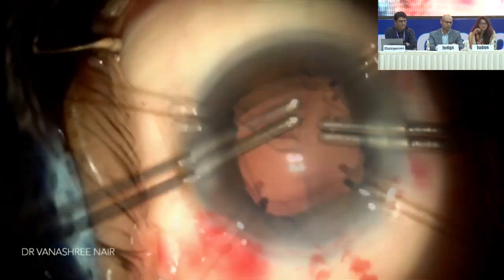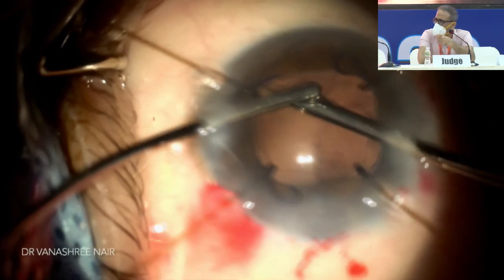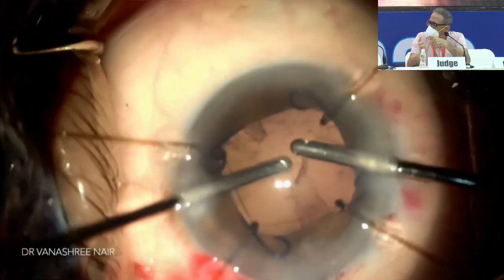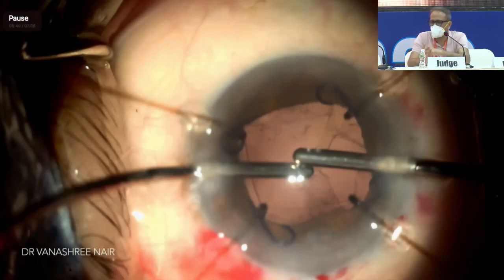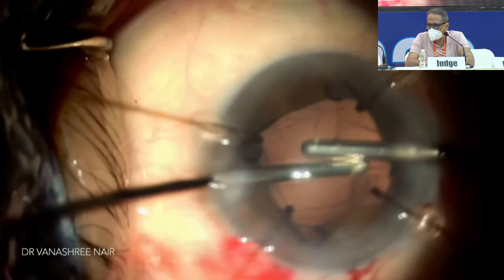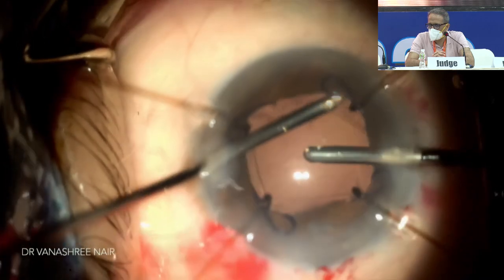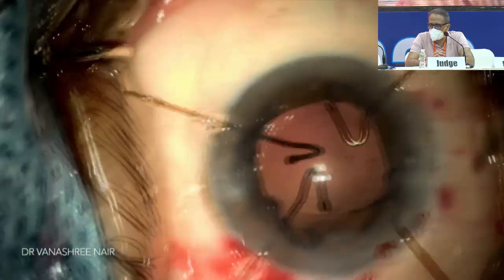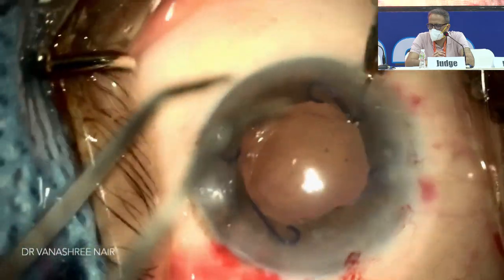I think so, because nowadays the hooks which are coming, the latest ones, they have the Chang ones. Yeah. So they have a wider design. So your idea is, should we take it out? Yes, you can take them out also at this stage, definitely. I think it depends on the amount of laxity also. If you feel that yes, they are required, or maybe I actually prefer to keep it in, so it still stretches your bag and makes it a little easier for the irrigation aspiration. Right. So that we are not pulling on the anterior capsular edge by mistake. So then I got the capsular hooks out. And I had planned a three-piece IOL for this patient.